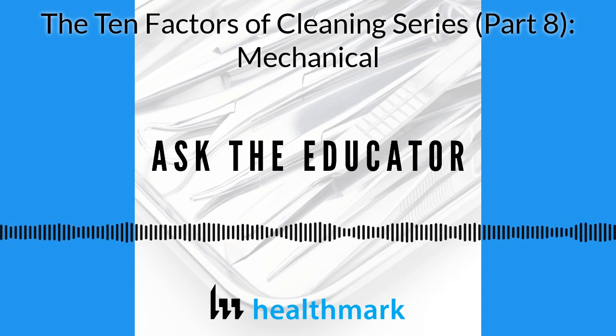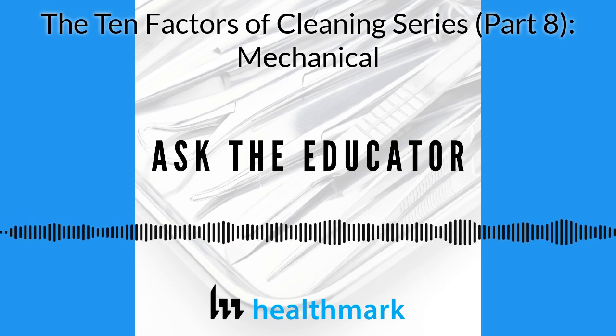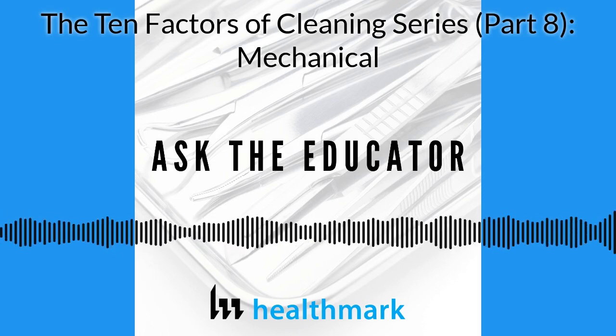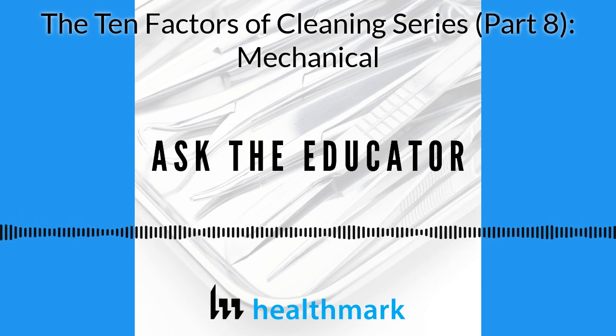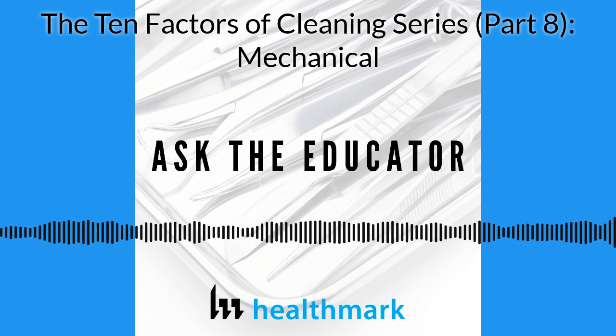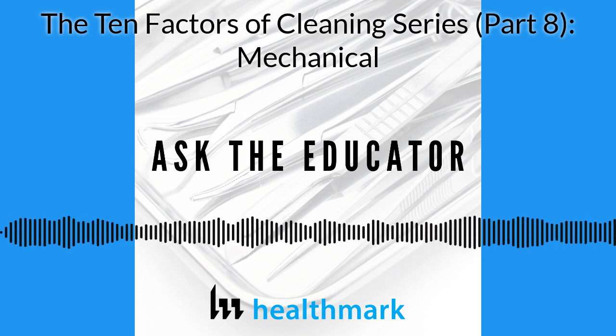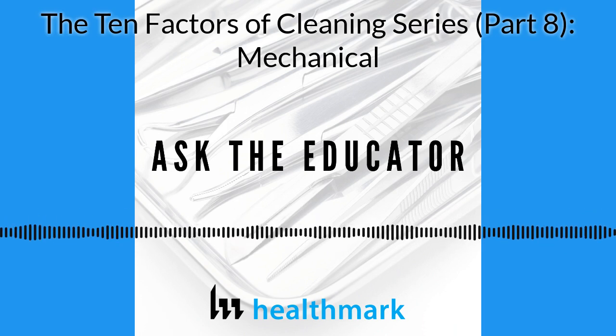In fact, there are some really good articles that have been written in Zen Central and some other places about the water pressure and impingement and cleaning. And now think of this. We're supposed to use low foaming detergent. So all of a sudden, think if you've got too much detergent and you have foam. Now, instead of that water coming and spinning, you're getting all this foam and it's not going to turn the right way. It won't rinse the right way. So there are a lot of things that can go wrong.